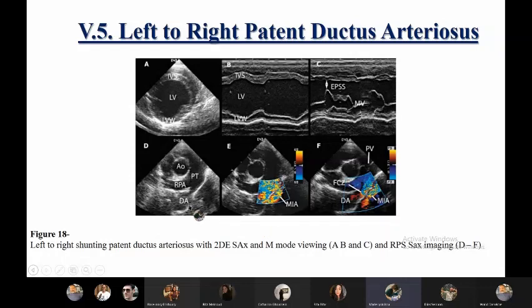D and F enable us to visualize the actual ductus arteriosus, and with the use of the color flow Doppler, the clinician can be 100% sure of its location. So in D, where there is a labeling of DA, the ductus arteriosus is obviously tapering and narrowing into the pulmonic trunk. There is a color flow Doppler in E at an abnormal location where blood should not actually flow, and it is not significant at all. This is a mirror image artifact. E and F are both systole and diastole, respectively, phases of this heart showing the turbulence flowing into the pulmonic trunk and back from it.